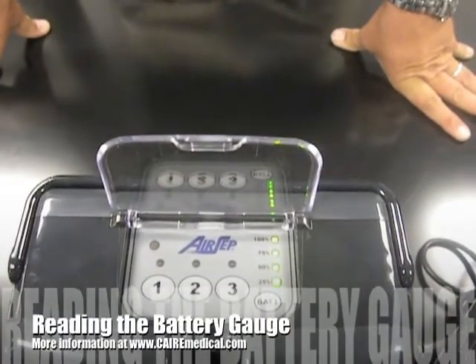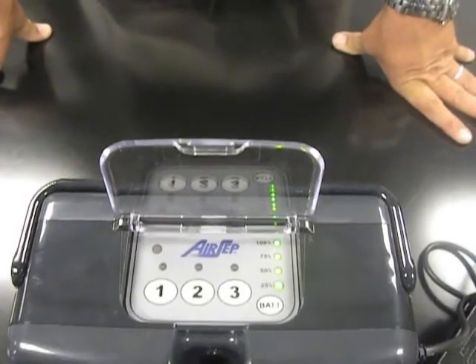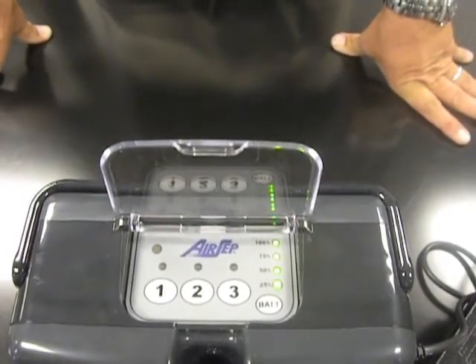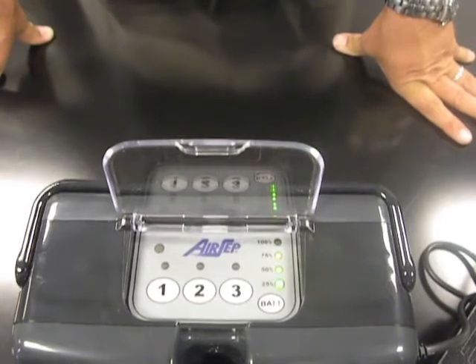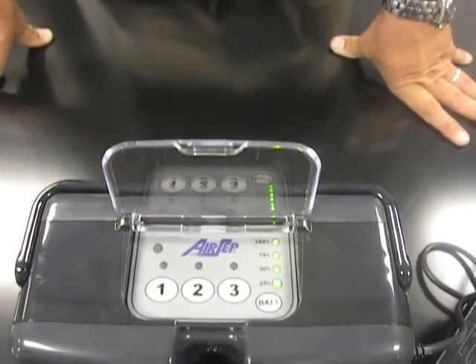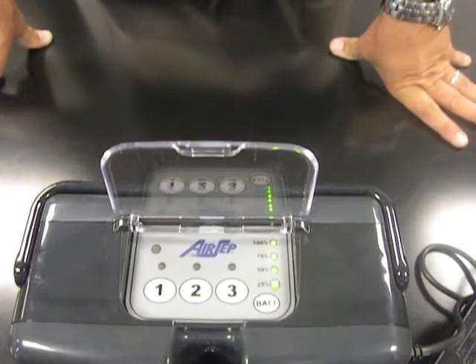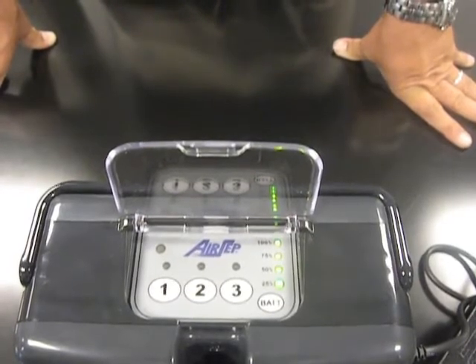To demonstrate the charging of the Freestyle portable oxygen concentrator, you can see there are a series of lights located on the control panel at the top. Any time the Freestyle is plugged into either AC or DC power, it will charge the battery simultaneously while it's in use. Currently, the battery is approximately 75% charged and the 100% light at the top is blinking. Upon full charge, all lights will remain lit for a few minutes after charging is complete, and then the lights will go out. Once the lights are out, your battery is fully charged and the Freestyle is ready to be used on internal battery.